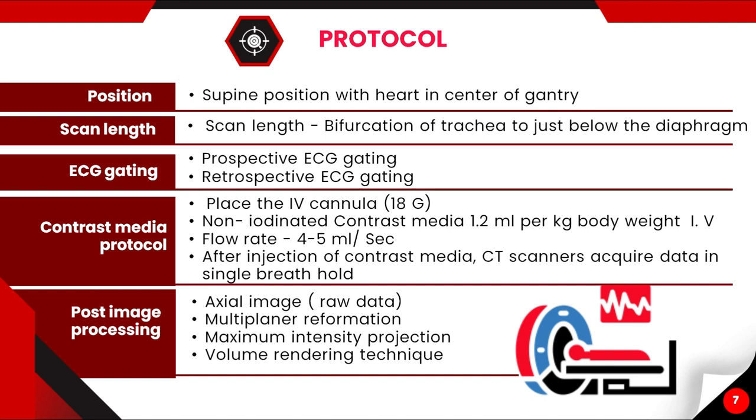For retrospective ECG gating, image acquisition is done continuously throughout the RR interval, and the data from selected points within the RR interval is taken for the reconstruction of the images. In our institute, retrospective ECG gating is done.